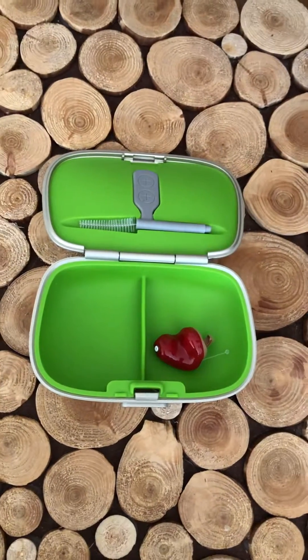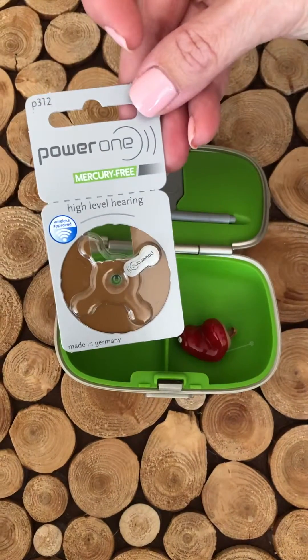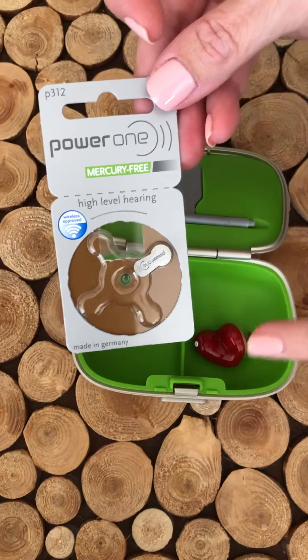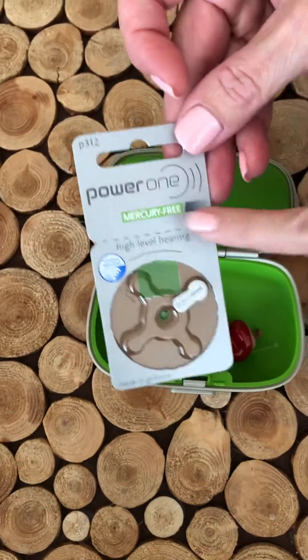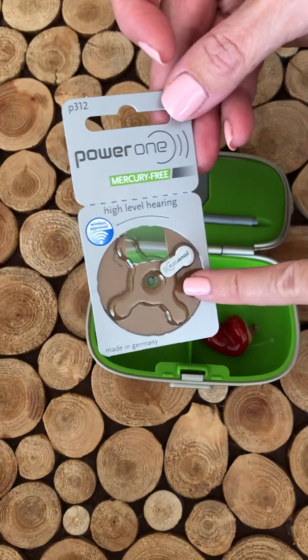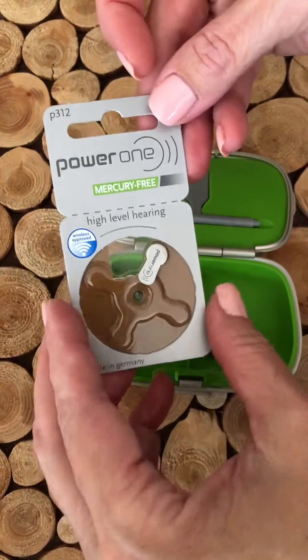Today I'm going to show you how to insert a number 312 battery. Here's a 312 battery — we're inserting it in a custom hearing aid. On the package, look for the number 312, or for color coding, 312 has brown packaging. Sometimes it doesn't have color coding; sometimes it just has the number.